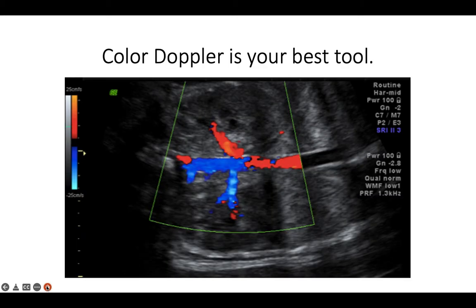The easiest way I've found to do this is in a coronal view using color Doppler. In this image, you can clearly see the aorta running horizontally and the right and left renal arteries branching off it.